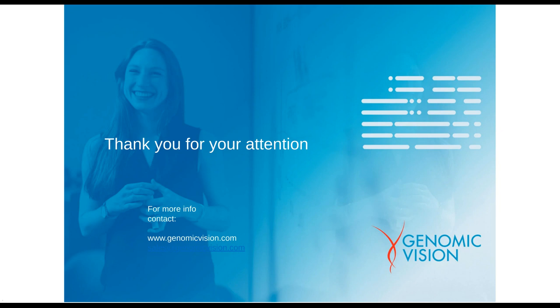The next question also relates to the FSHD clinical assay. Can the FSHD clinical IVD assay be used with blood, cells, or saliva? Yeah, thank you for the question. Really interesting. Yes, it can be used with blood and cells. At the moment, we don't use saliva. We usually ask to collect fresh samples coming either from the blood or from the tissue of the patient.